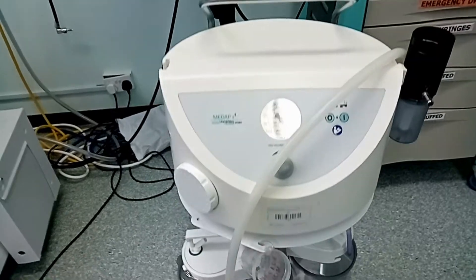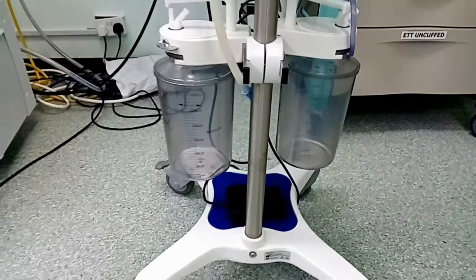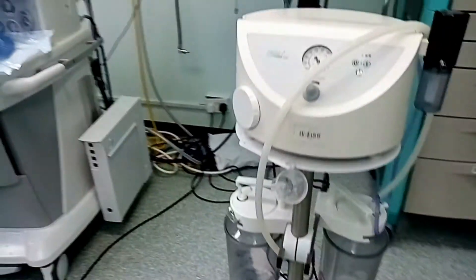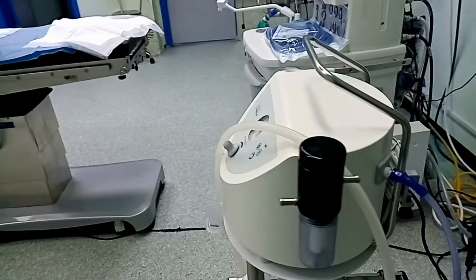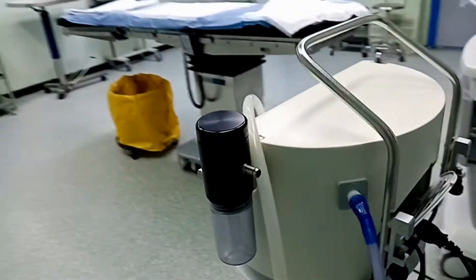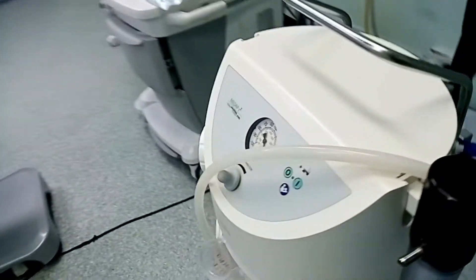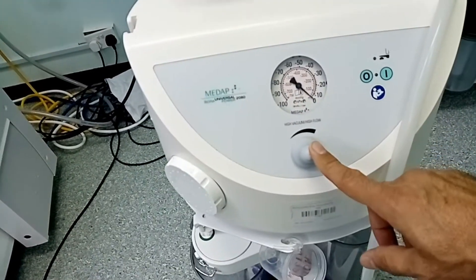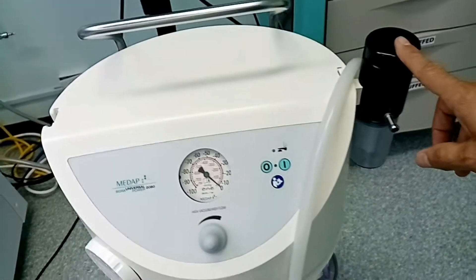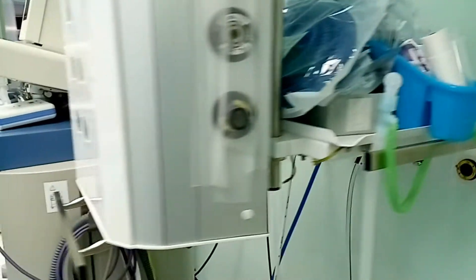ده جهاز شفاط السوائل. في نوعين من شفط السوائل: جداري أو مركزي، وفيه متنقل زي الجهاز اللي شايفينه ده. الهدف منه شفط أي سوائل بالإضافة للدم من المريض أثناء العمليات الجراحية. بيستخدم أكتر في غرف العمليات وأقسام العناية المركزة وعناية حديثي الولادة وبعض الأقسام الداخلية. ونوع تاني من أجهزة شفاط السوائل اسمه البندنت.